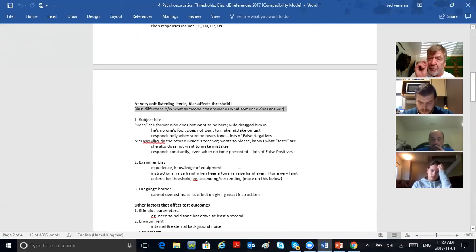We said last week, bias is the difference between what you can hear and what you say you hear. That's when you can get two kinds of people. That's when we talked about Herb and Mrs. McGillicuddy. Herb, the farmer who doesn't want to be there. Herb, the macho man that doesn't want to make mistakes. He doesn't want to raise his hand when he's not sure. He's going to wait to be sure he hears the tone before he raises a hand. If his hearing loss is 50 decibels, he's going to wait till the tone is 60 before he raises his hand. He wants to be sure.